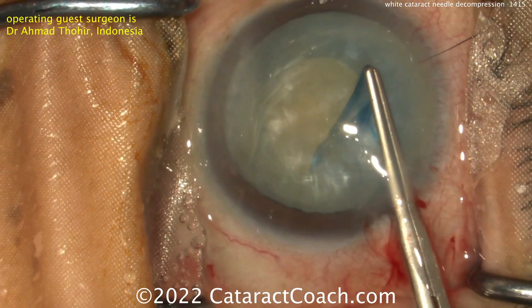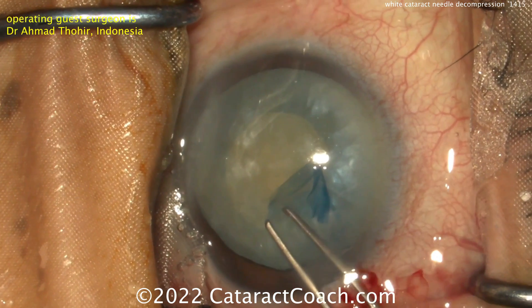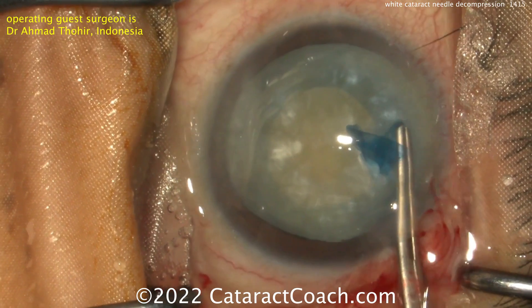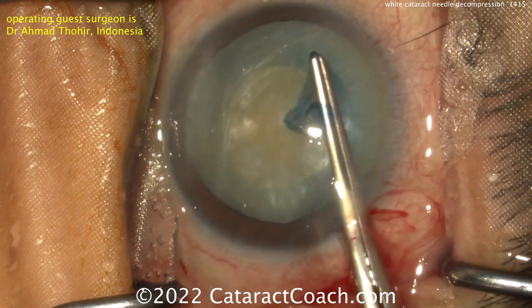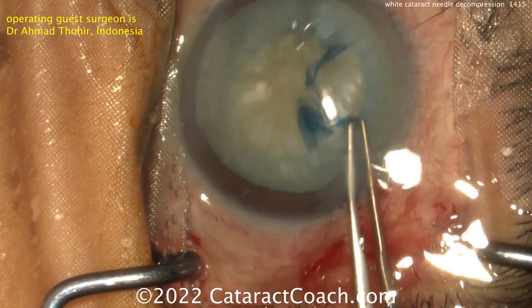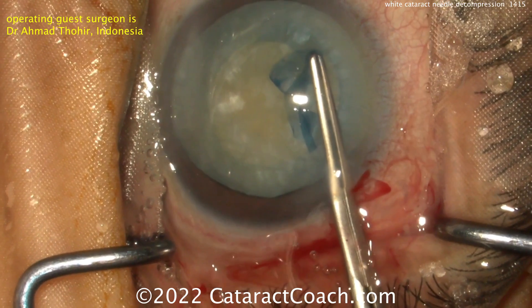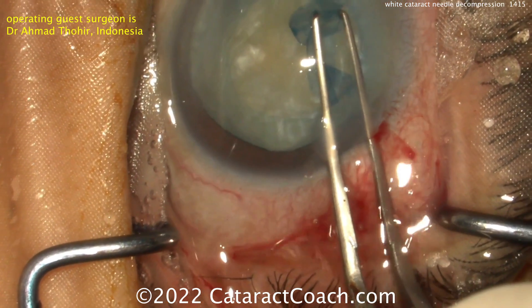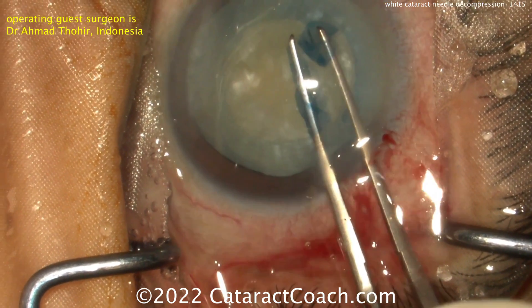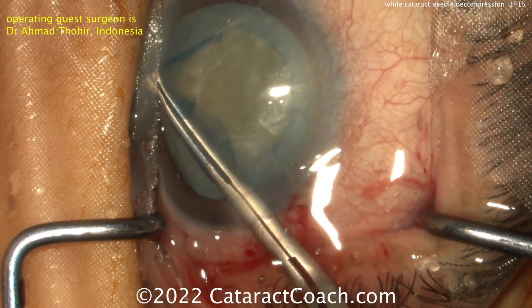Err on the side of being a little on the small side, because you can always spiral it out. You want to be prepared at any moment to bring it in and quickly finish it up. Also remember, the liquefied lens material is not just above the lens nucleus — it's also behind it. So you want to rock that nucleus after you aspirate some of the anterior liquefied cortex, to get some of that posterior fluid to come around the equator of the nucleus, and then aspirate that as well.